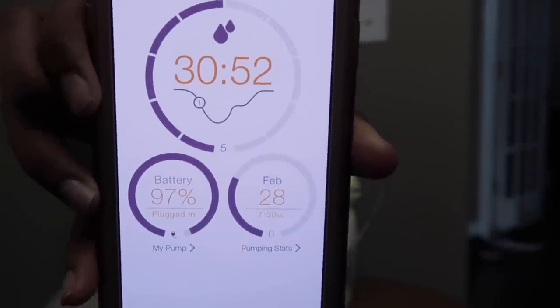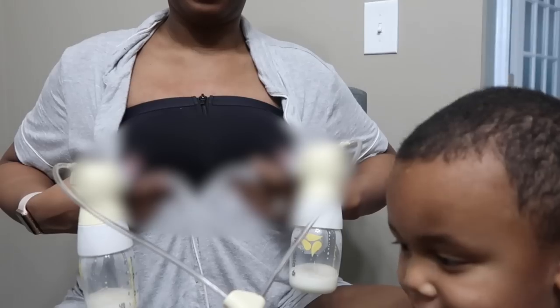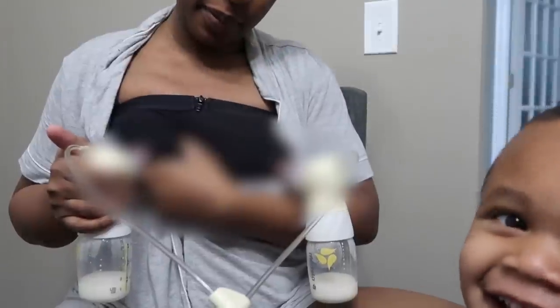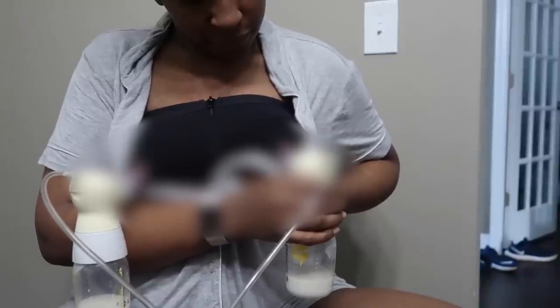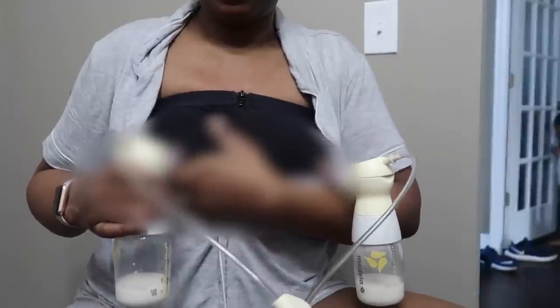Now that I've hit the 30 minute mark, I am ready to get off the pump. I check to make sure there is not a lot of milk coming out. If I'm not expressing a whole bunch, I carefully remove the cups and get off the pump. But before I do that, I like to squeeze it out just in case — because sometimes if I'm on the pump too long, my body will start another letdown, and when that occurs you just have to stay on the pump and get that milk out.